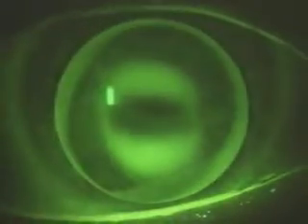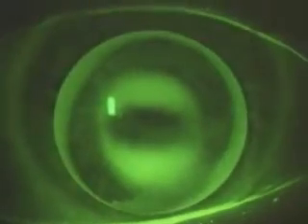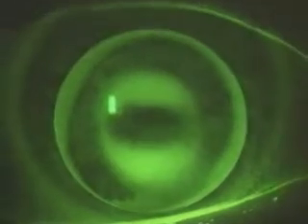The central fitting characteristics on a keratoconic eye are very important as they determine the physical and physiological performance of the lens. Begin by analyzing the central post-lens fluorescein pattern. If the pattern shows excessive pooling, then fit a flatter radius to achieve light or feather touch on the apex of the cone.